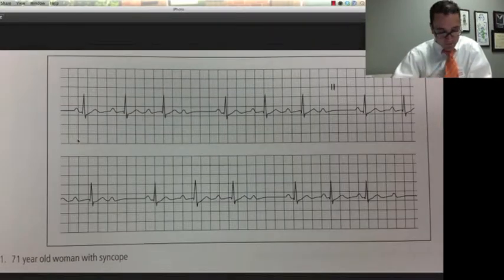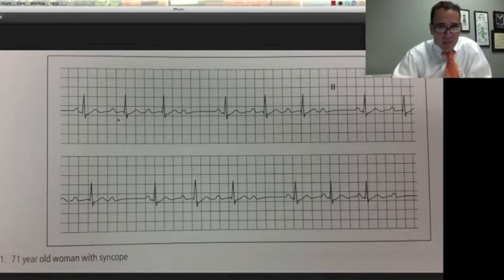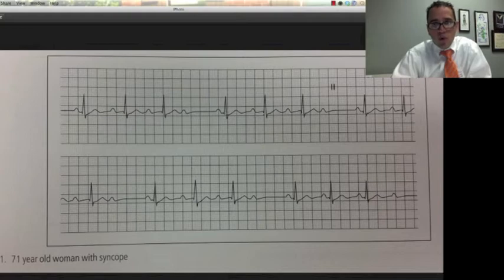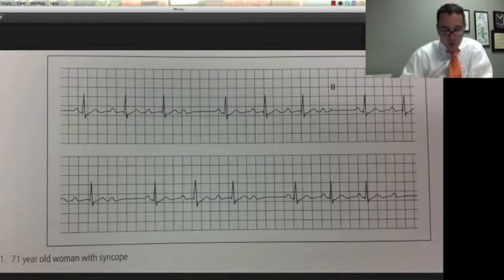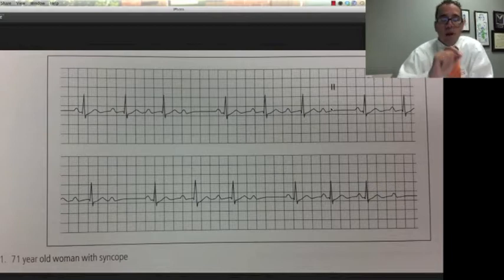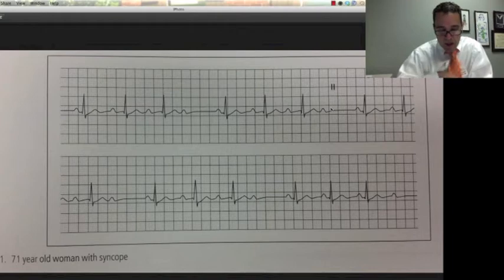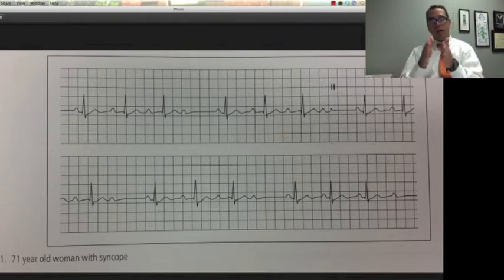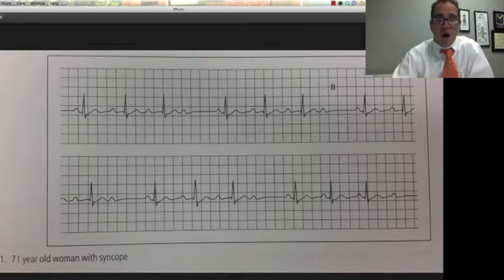Here is a sinus rhythm. It also looks like a first degree AV block, but the PR interval gets a little longer here, then it gets dropped altogether — there's no QRS. Short, longer, longer, drop. That is called the famous Wenckebach block, or Mobitz type 1 AV block. The characteristic finding is the prolongation of the PR interval until a P wave gets dropped.